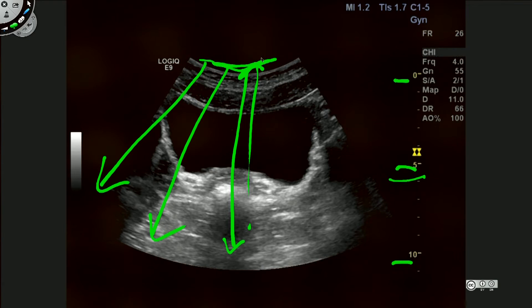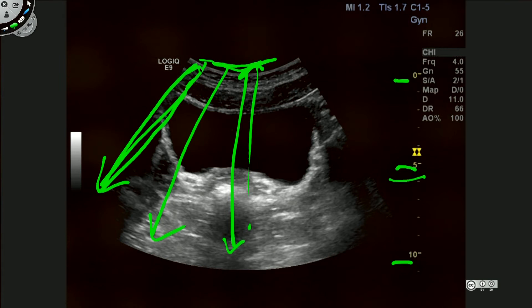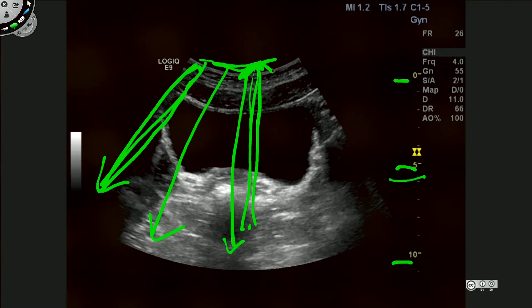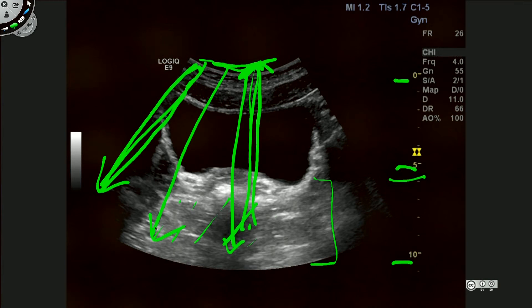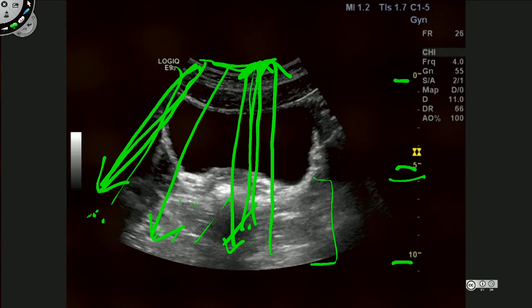It's easy to appreciate from this image that sound waves travelling through the adjacent tissue and back up again will have a certain degree of energy associated with them. Whereas sound waves passing through this area, because they pass through a distended urinary bladder full of fluid, when they come back to the transducer they have a much higher signal. If you look beyond the urinary bladder, you can see that this area has a much higher signal than the area out here, because the sound waves have passed through the urinary bladder here and not over here.